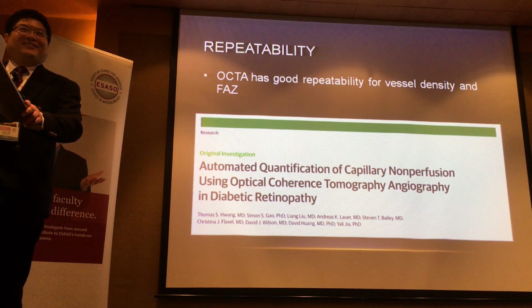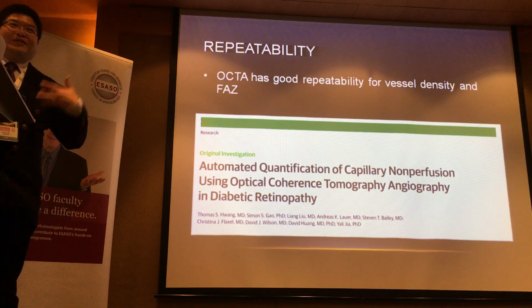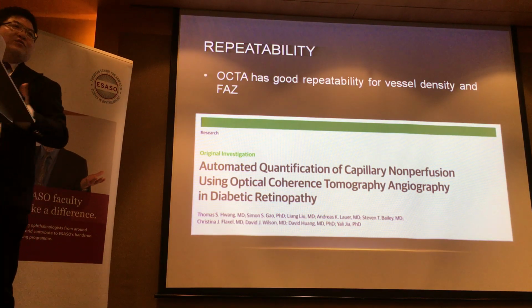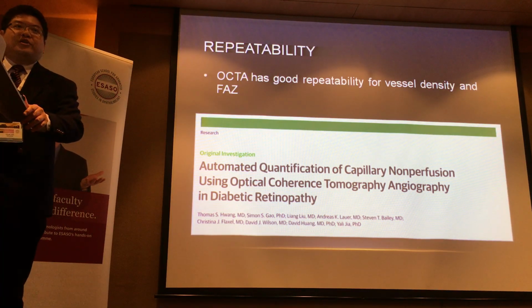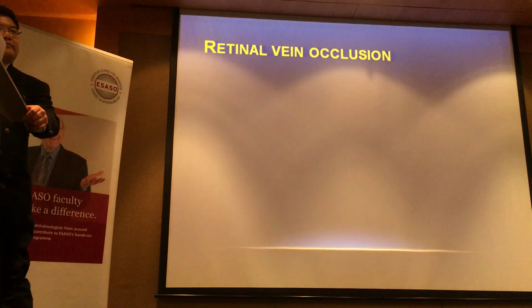But in the clinic, right? We can't do that. Obviously, we can't even take two. We don't even have the resources to take two scans, much less get someone to do a composite and process it. It's going to take too long. The patient is not going to wait. So something to know and remember.